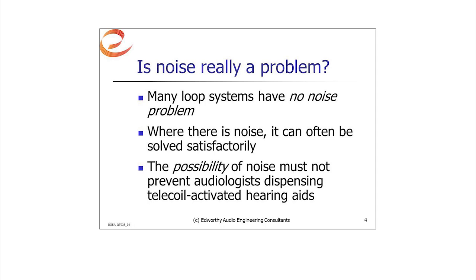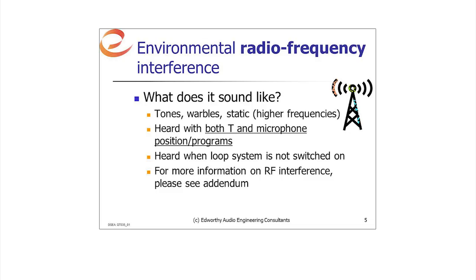Well, is noise really a problem? In my experience, many loop systems have no noise problem at all. And where there is noise, it can often be solved completely satisfactorily. And really importantly, the possibility of noise mustn't prevent audiologists from dispensing hearing aids with telecoils activated. I think there is sometimes a worry that noise will be a problem for hearing aid users, and this may stop some audiologists from dispensing hearing aids with telecoils.